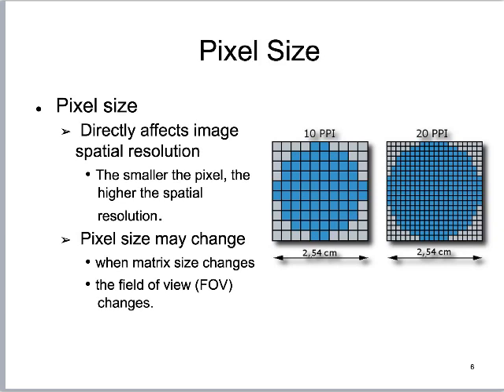In trying to figure out how we move from the little pixelated skeleton to something that has diagnostic value, a big part of that has to do with pixel size. The clumpy looking skeleton has a very large pixel size. As we shrink the pixel size smaller and smaller, we are getting better and better spatial resolution. So what we're asking is, how do I represent the patient's body as very small little squares? Because if I do that, I will have good spatial resolution, good high contrast resolution.